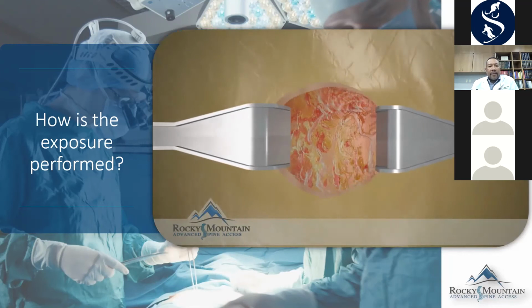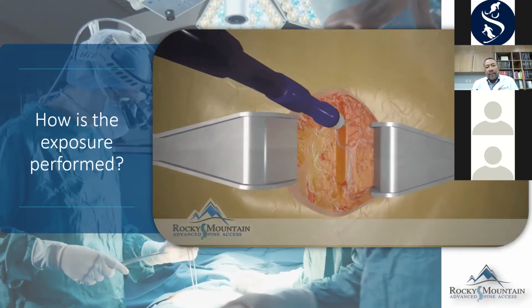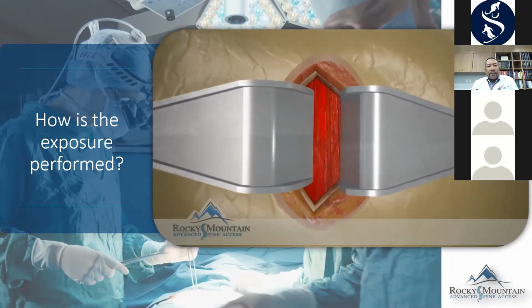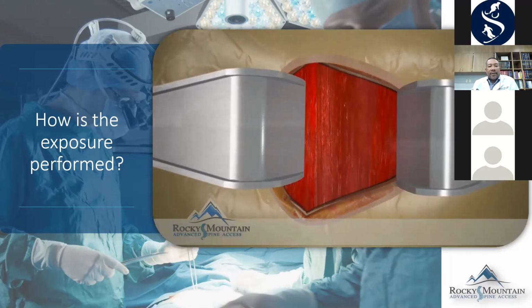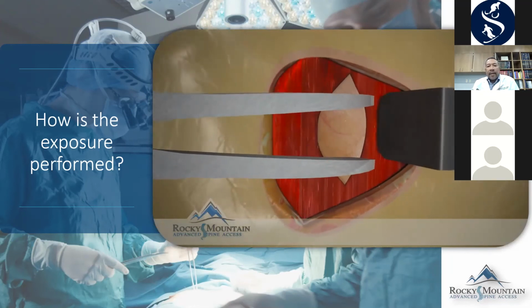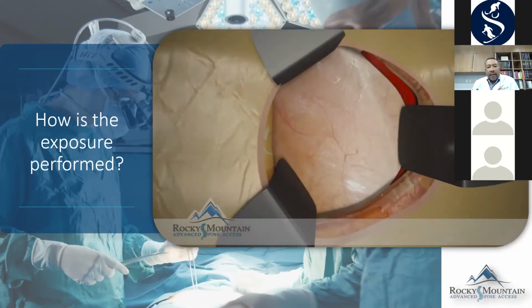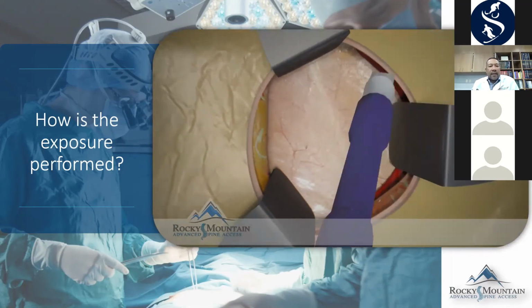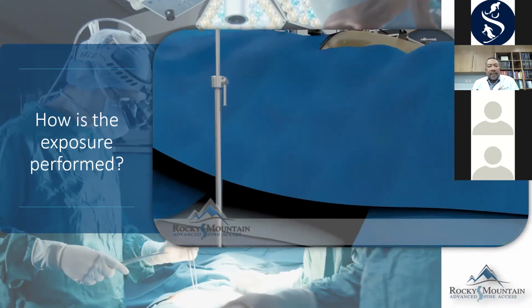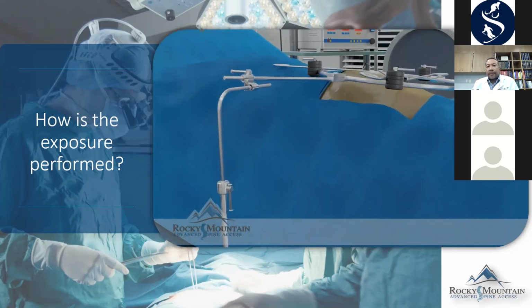The peritoneum, which contains most of the organs, the bowel, is all mobilized retroperitoneally. The veins are protected with retractors, and the spine is safely approached. This is done by my spine access surgeon. Once the spine access is accomplished, that's when we go and remove the diseased and damaged disc and replace it with a new one, a prosthetic device. Most patients stay in the hospital for 1 to 2 days and need about 6 to 8 weeks of physical therapy, which consists mostly of nerve glides and core strengthening.